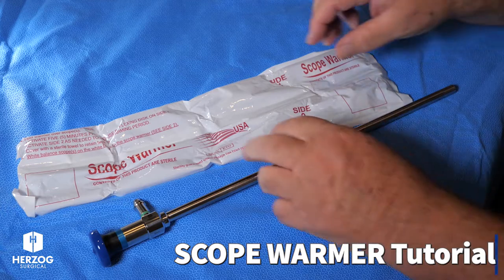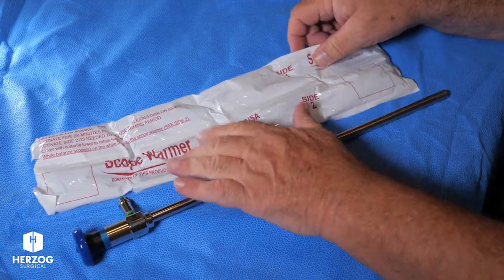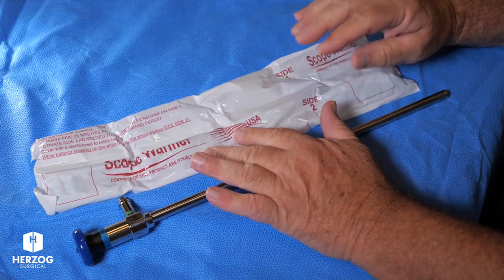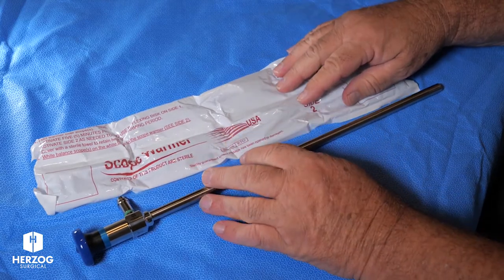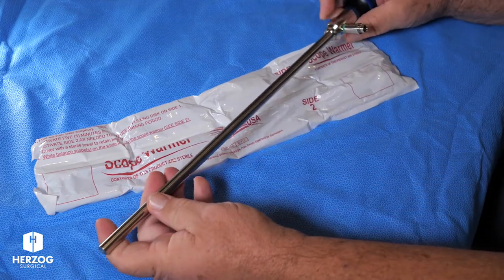Hi, I'm Jim with Herzog Surgical. I'm happy to show you one of our problem-solving items we carry. This is our scope warmer. It's a low-cost, simple way to prevent fogging on your cold endoscope.